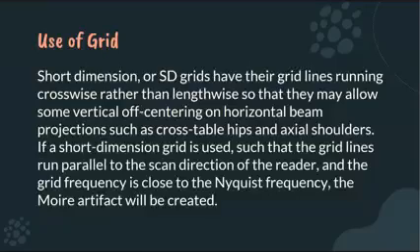With the same frequency. Traditionally, this artifact could be caused by superimposing two linear grids. When two linear grids have the same frequency, Moiré artifact will be produced. However, in digital imaging, it is not called Moiré artifact anymore. That term is only for film screen. With CR imaging, the Moiré artifact is actually much more likely to occur. This electronic version is called an aliasing artifact.